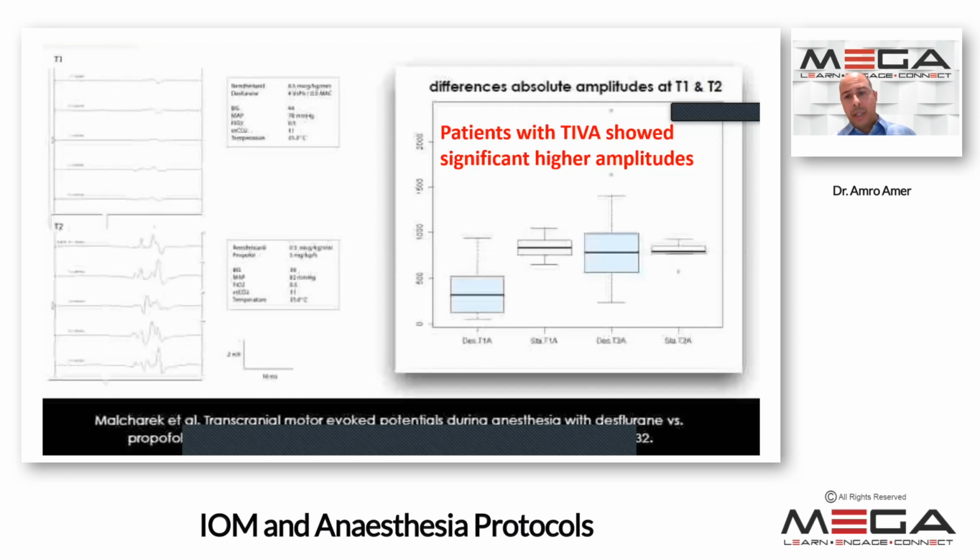Then during surgery, if there is an iatrogenic change coming from the patient, I cannot tell, because the baseline usually goes down. Let's say I have a baseline amplitude of 100. It goes down slowly to 90, 80, 70. I'm not sure at that time if it is from the patient or from the anesthetic.